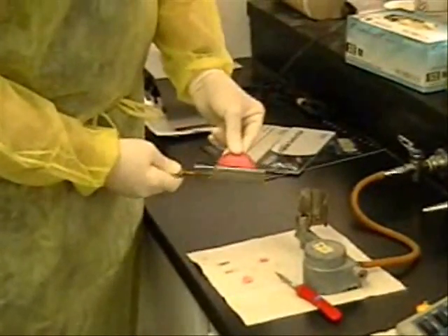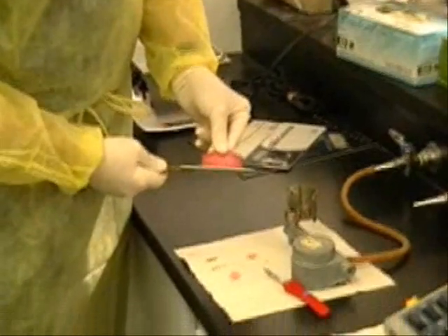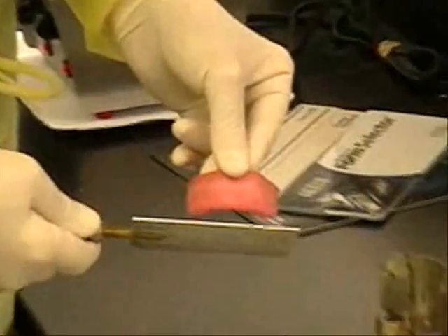Let me just kind of go back down. Tuck it down just a little bit. There you go. Just kind of move around — yeah, great. Perfect.